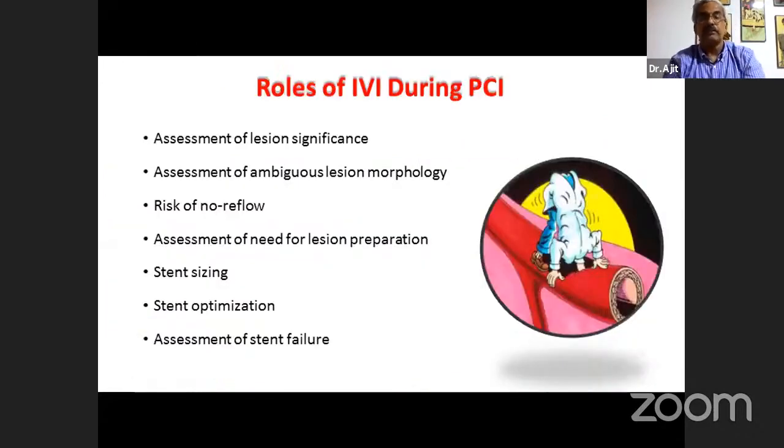You should know that. So when you do intravascular imaging of the patient, we should do it in a very serious way. When I mean serious, it has to be a proper run. You have to run it before, you have to run it during, and you have to run it after. And during, before, and after, there are various issues which you look at.